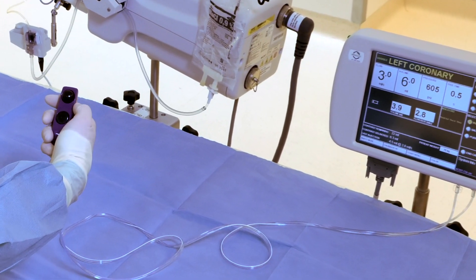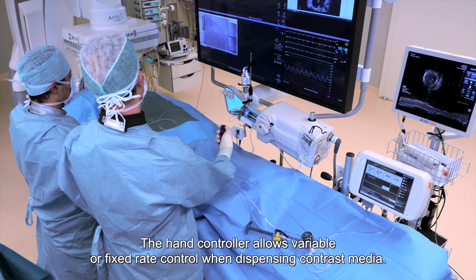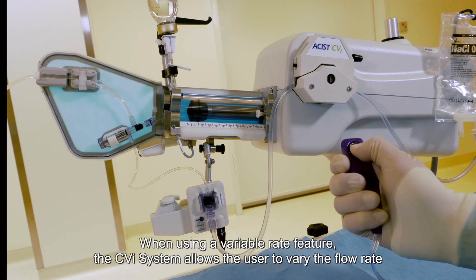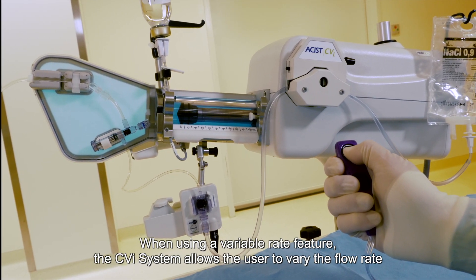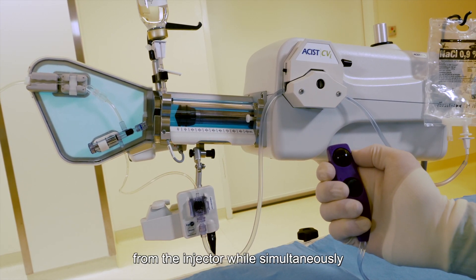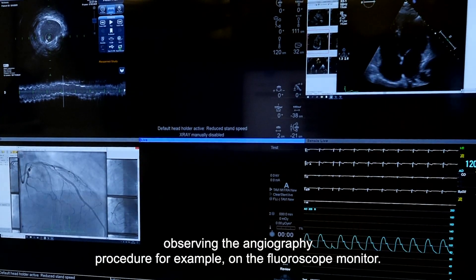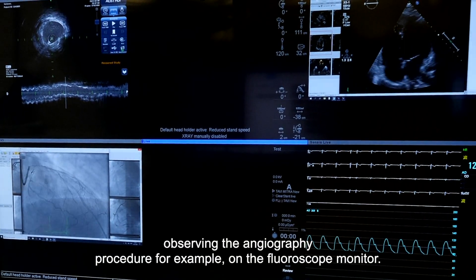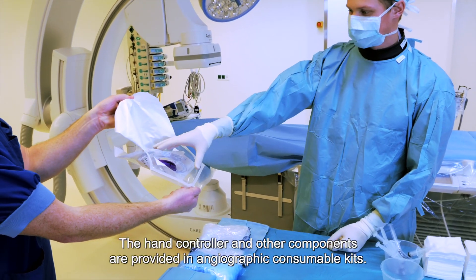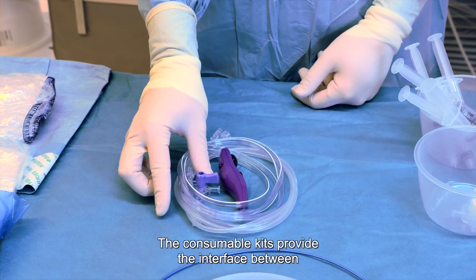The hand controller allows variable or fixed rate control when dispensing contrast media. When using the variable rate feature, the CVI system allows the user to vary the flow rates from the injector while simultaneously observing the angiographic procedure — for example, on a fluoroscope monitor. The hand controller and other components are provided in angiographic consumable kits.